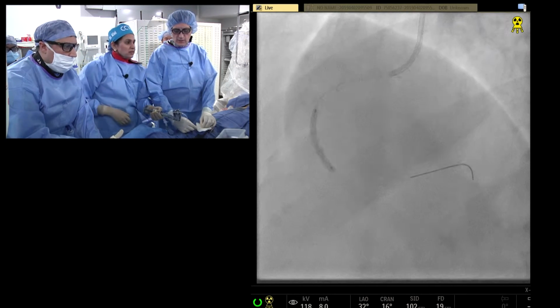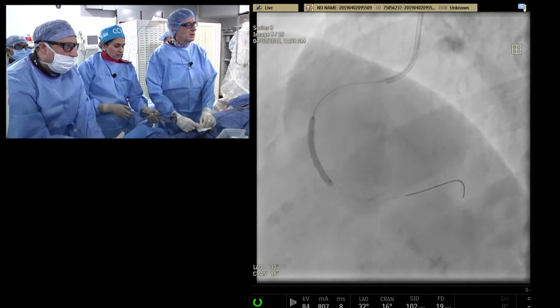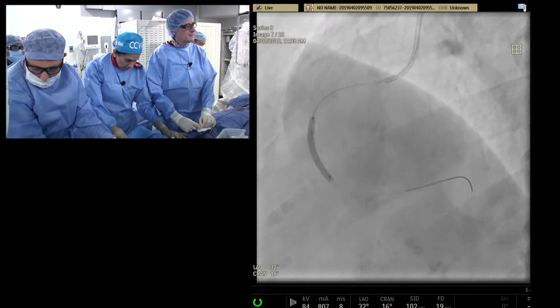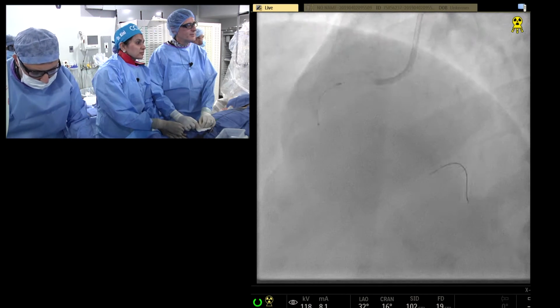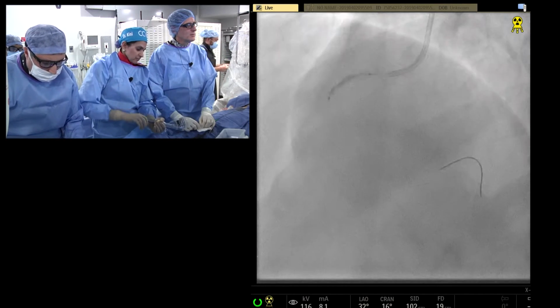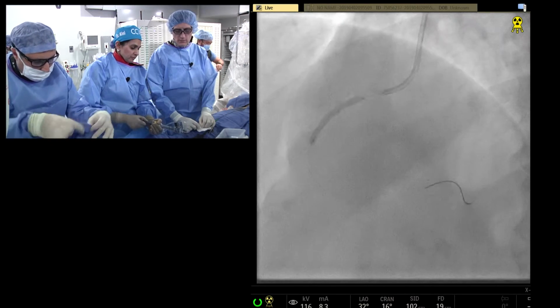If there is a very calcific vessel that you're not going to be able to expand before you put your stent in, and you didn't do atherectomy, you're going to get a bad result. So she now found with that intravascular ultrasound that she doesn't need to do the rotational atherectomy or a really, really big procedure that grinds the calcium before you put the stent in or breaks up the calcium.